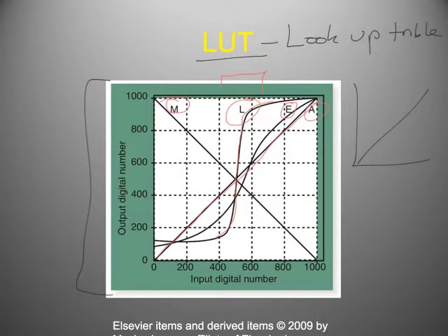So one of the big takeaways here in this chapter to that point is on page 292, the final penguin box. He says, computed radiography should be performed at lower techniques than film screen radiography. Well, what's he talking about?